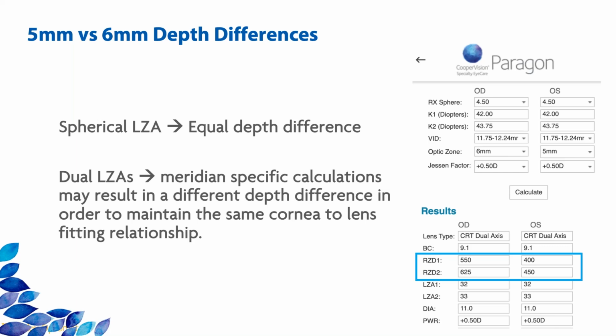Fantastic, thank you. Another question that we have is, do you fit based on the topo corrected for angle kappa or based on the topo with fixation directly? So I guess uncorrected for angle kappa. What is your preference? This is a great question.